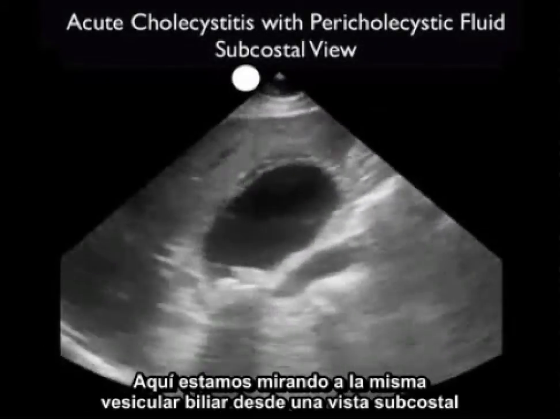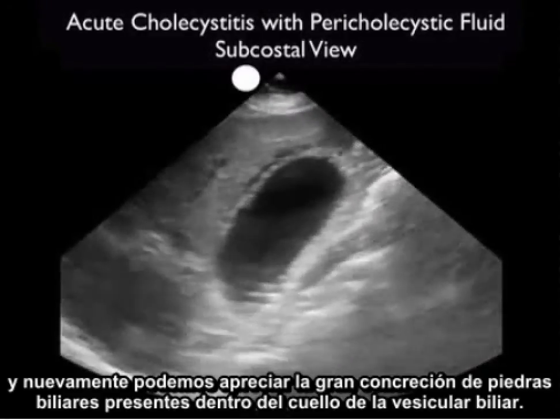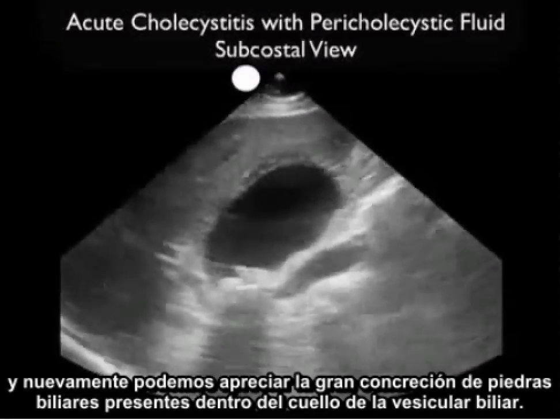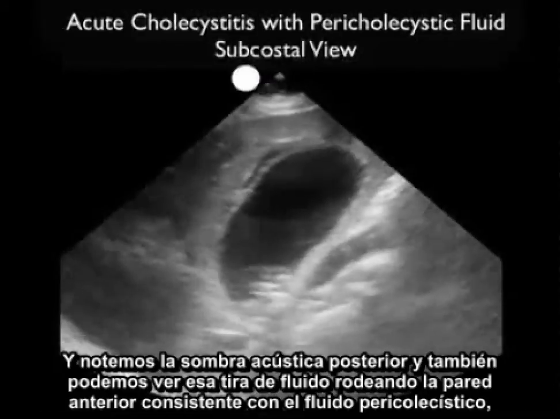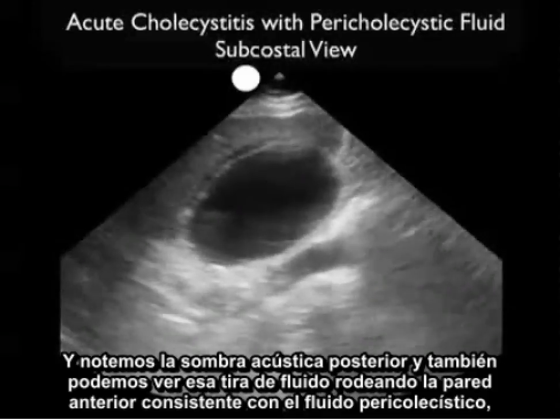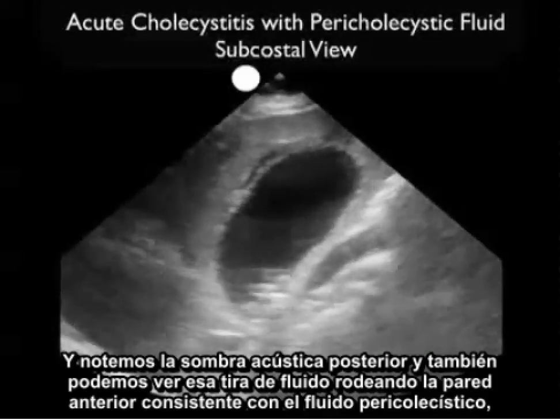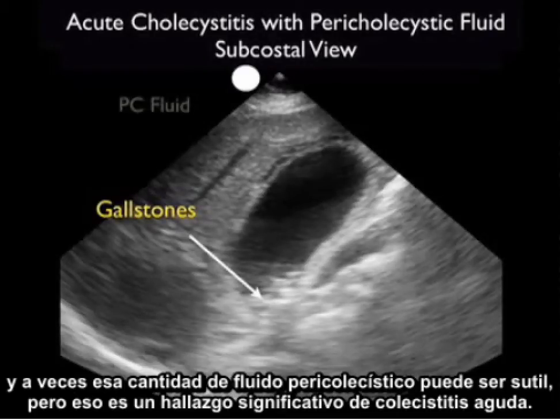Here we're looking at that same gallbladder from a subcostal view. Again we can appreciate the large concretion of gallstones present within the neck of the gallbladder and note the posterior acoustic shadowing. We can also see that stripe of fluid surrounding the anterior wall consistent with pericholecystic fluid. Sometimes that amount of pericholecystic fluid can be subtle, but it's a significant finding for acute cholecystitis.